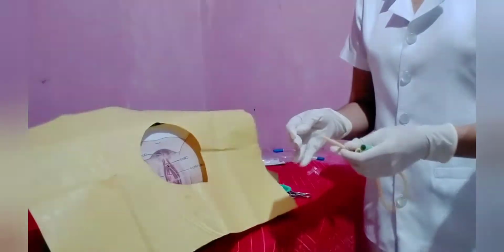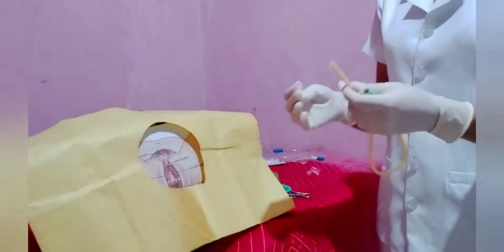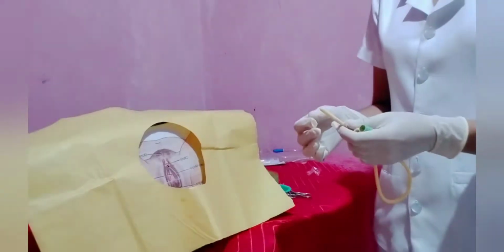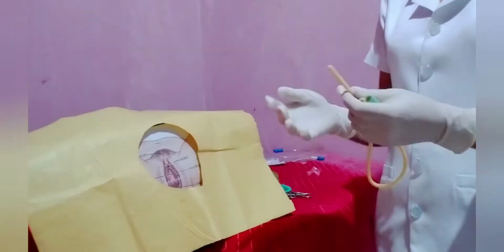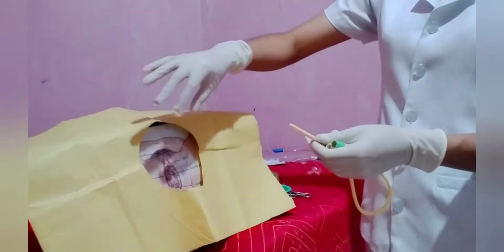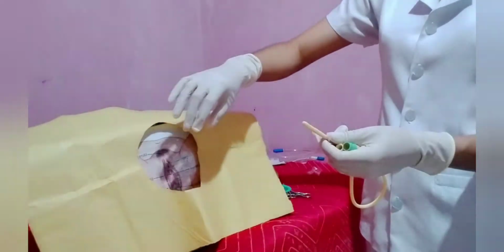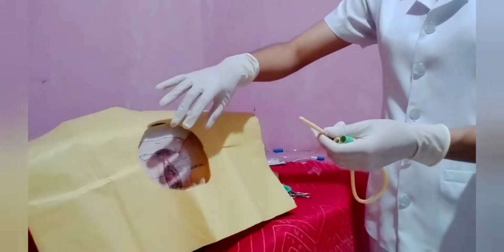So after that, pick up the catheter at least 3 inches from the tip. Place the thumb and one finger of the left or right hand between the labia minora. Separate and pull up gently. Separating the area surrounding the meatus provides visibility.